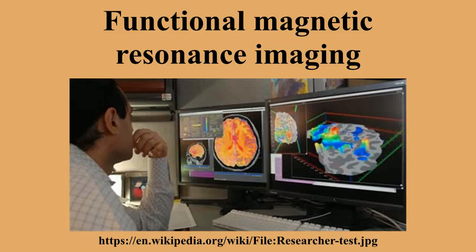For fMRI specifically, the hemodynamic response lasts over 10 seconds, rising multiplicatively, peaking at 4 to 6 seconds, and then falling multiplicatively. Changes in the blood flow system, the vascular system, integrate responses to neuronal activity over time.